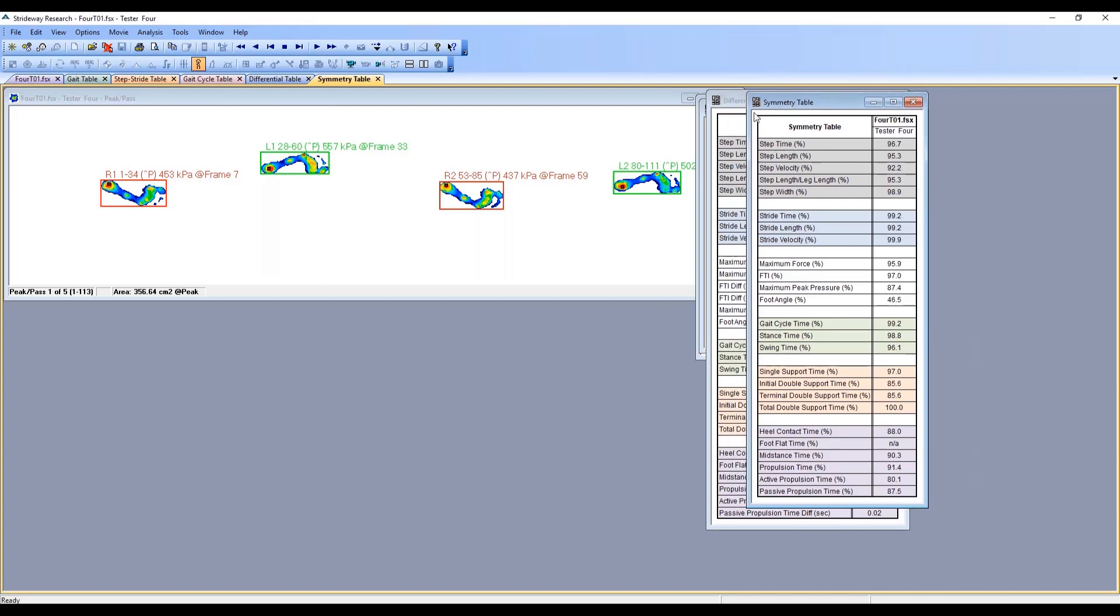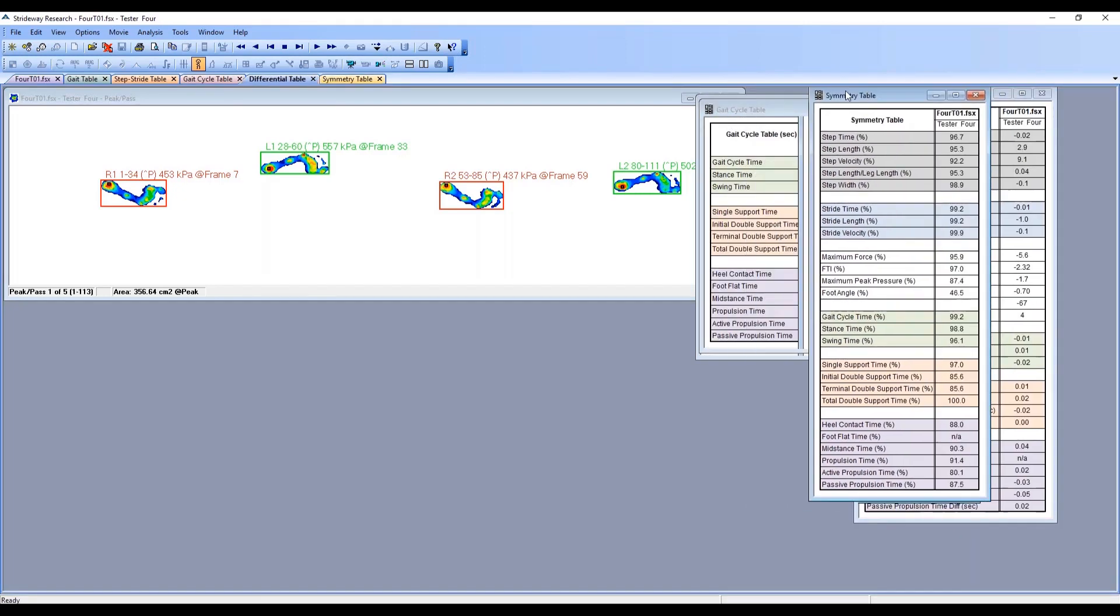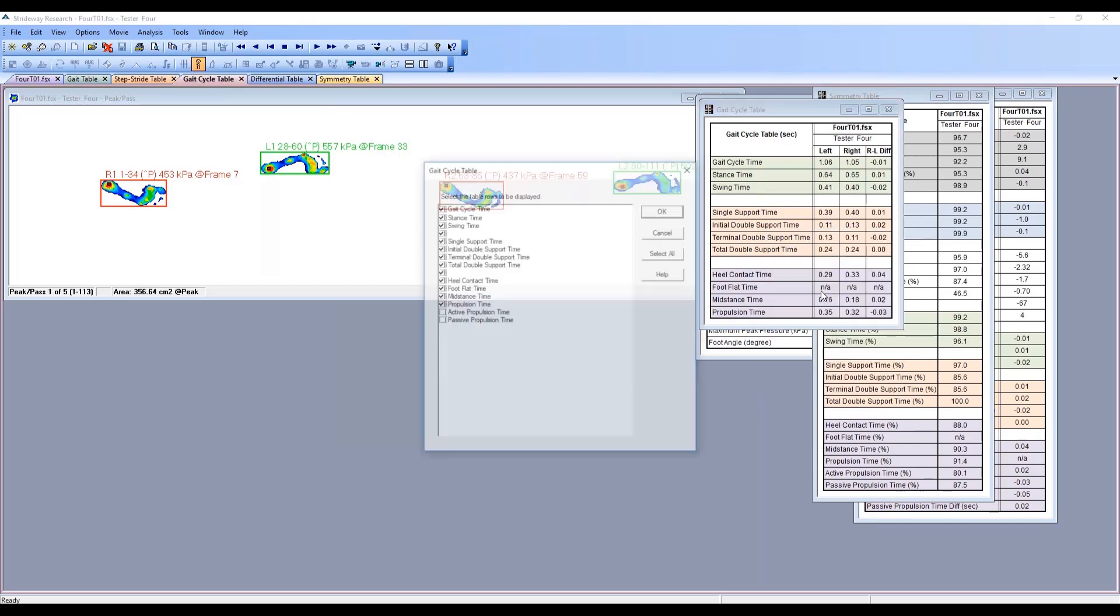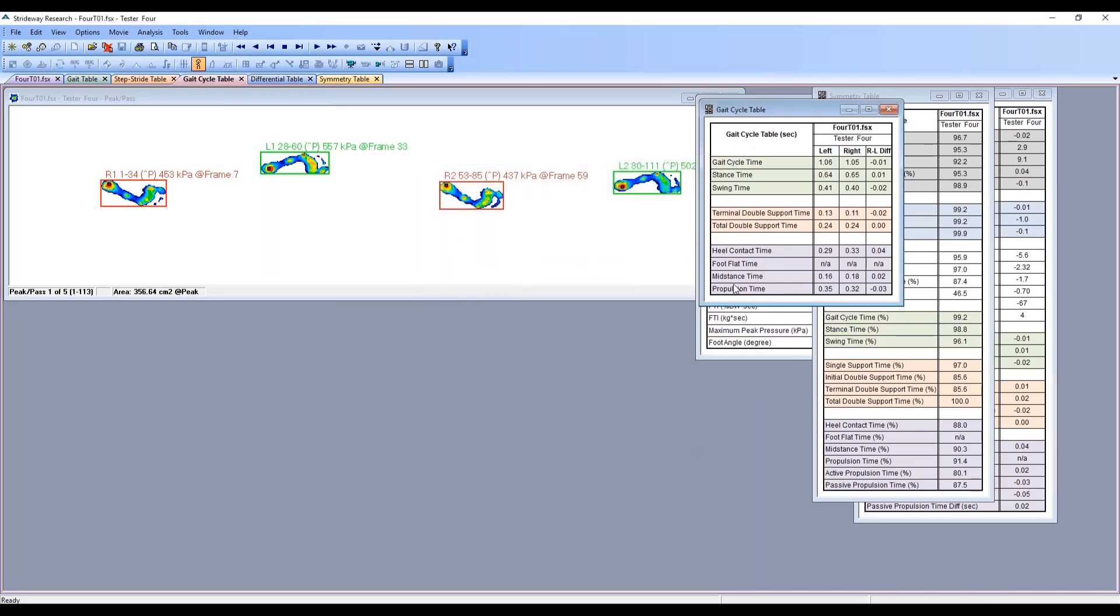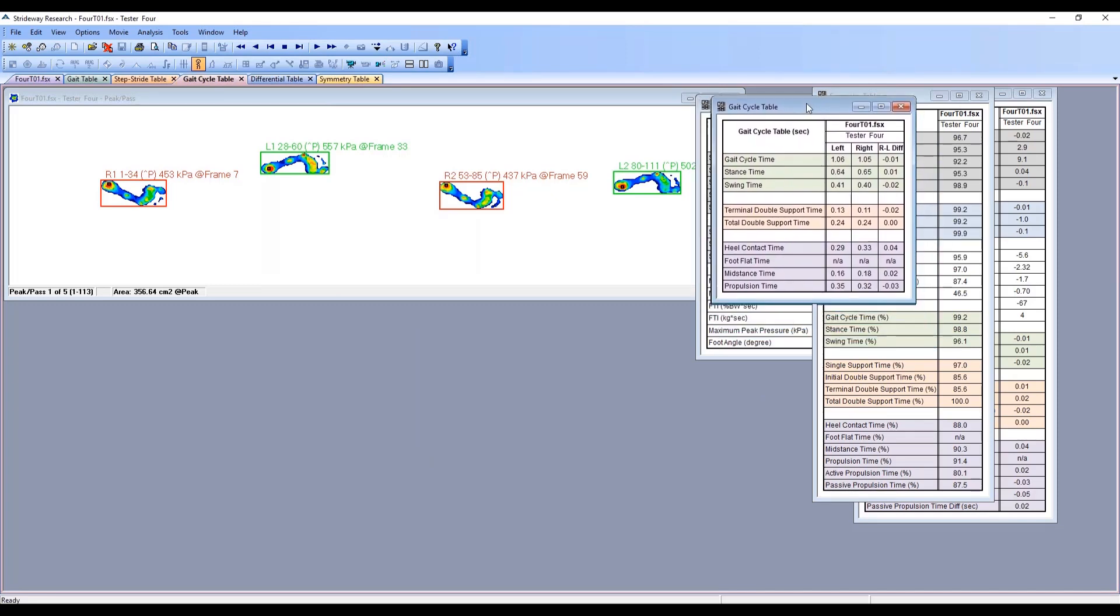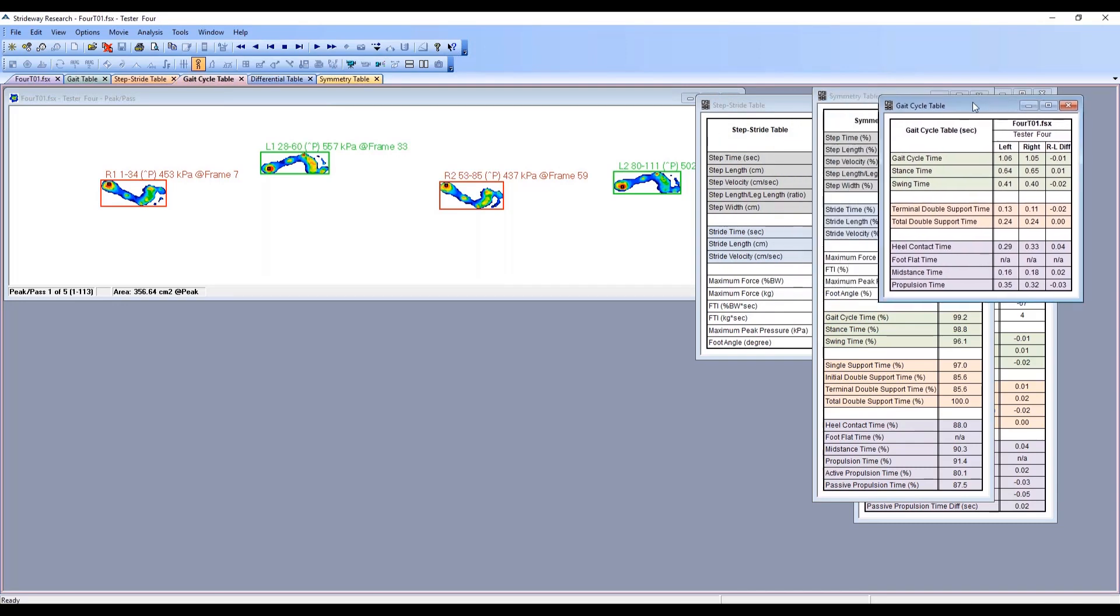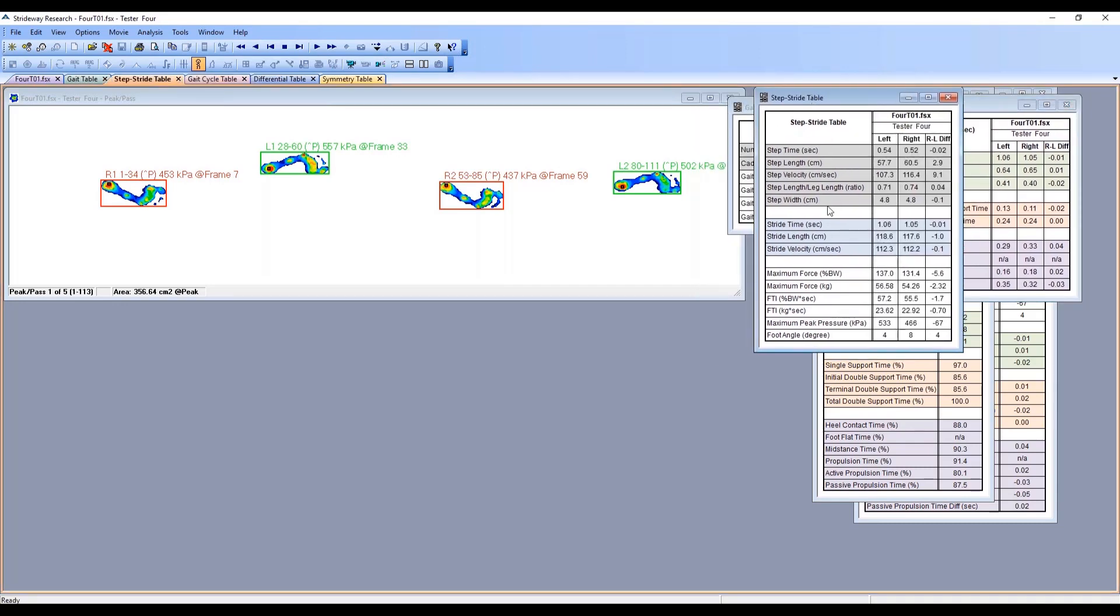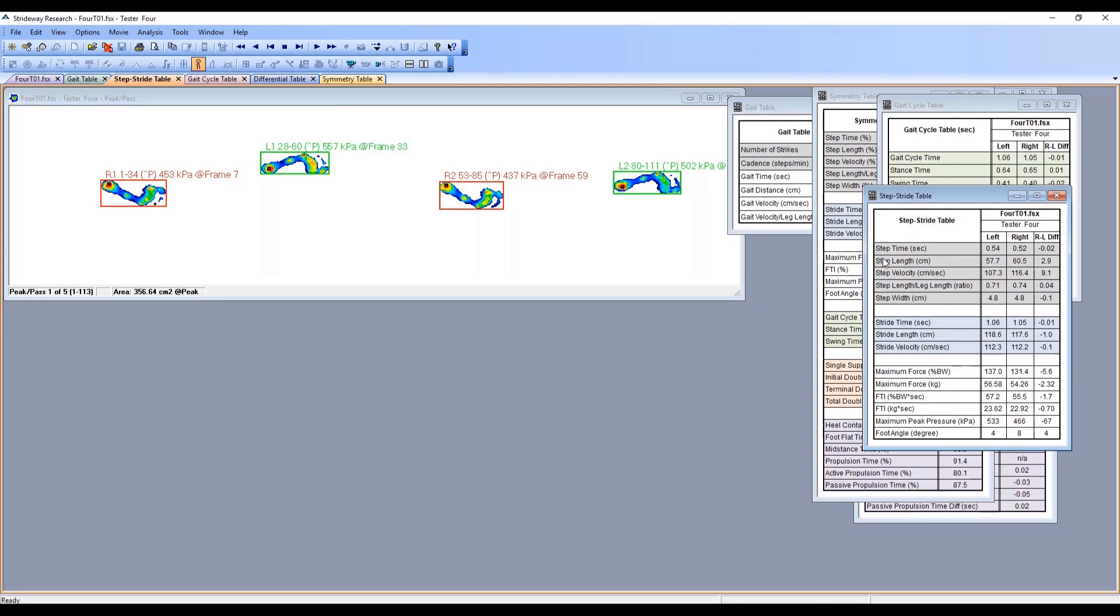You can remove some of these parameters in the tables if you don't want to see them. Simply do a right click, select table rows, and then you can choose certain parameters that aren't of interest to you and choose to remove them. Then they'll only show the ones that you've actually selected. This can be helpful if there's just way too much information and you want to look at specific things in the gate cycle table. This takes care of our spatial temporal information from the strideway.